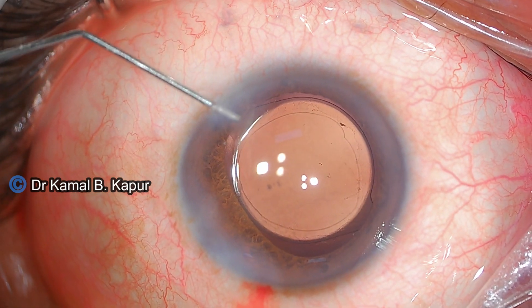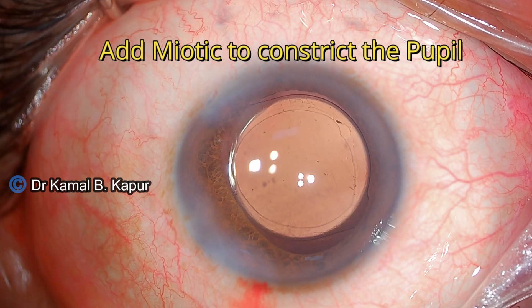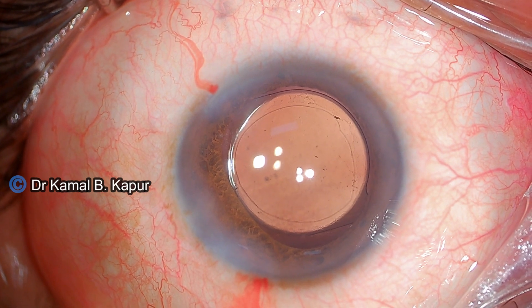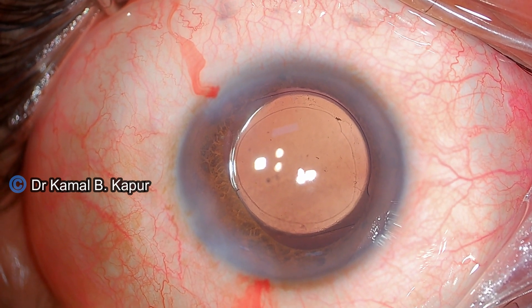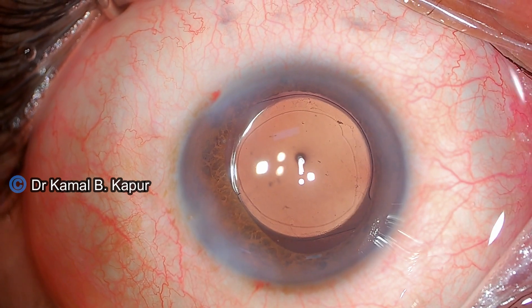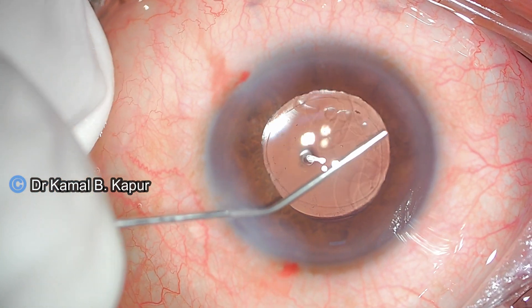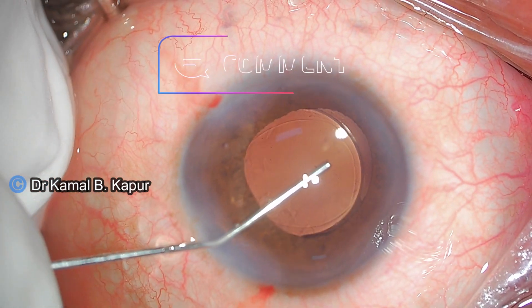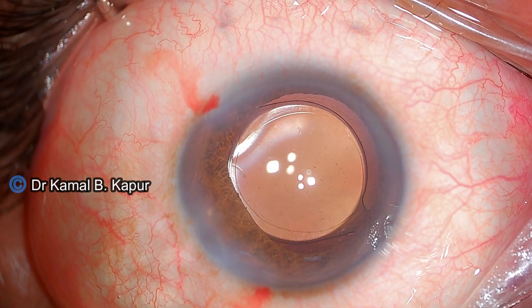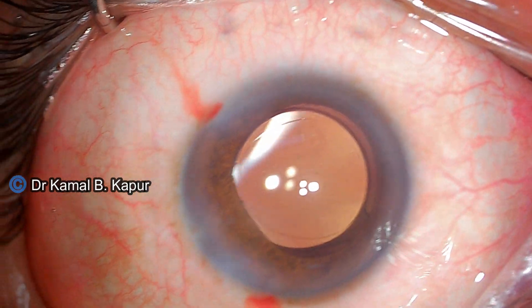Next, we instill a miotic to constrict the pupil. Constriction of the pupil causes better visualization of the angle and its structures. This is followed by instillation of sodium hyaluronate into the anterior chamber to distend it adequately. One important point: we should not overfill the anterior chamber, as it may blanch the angle structures and hamper visualization of Schlemm's canal and the trabecular meshwork.